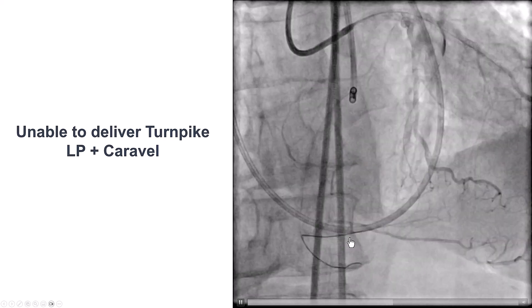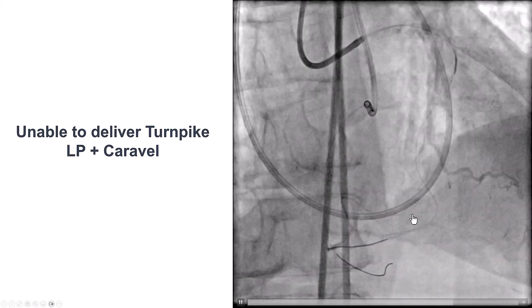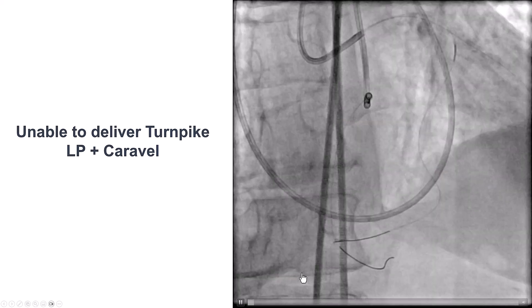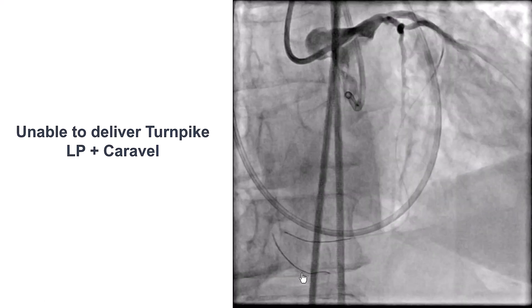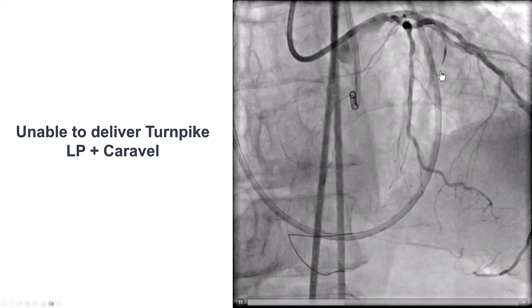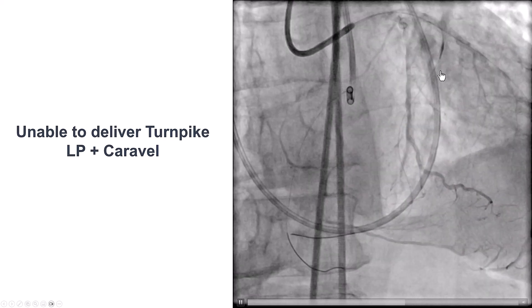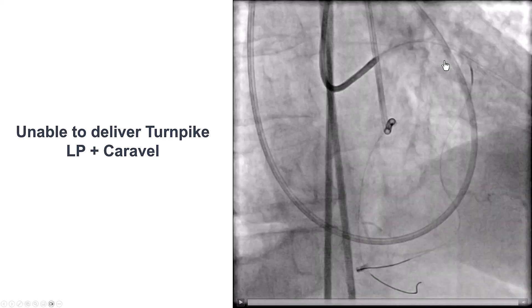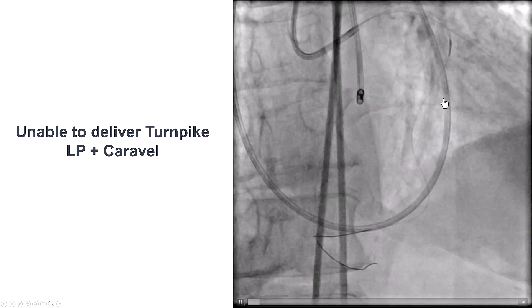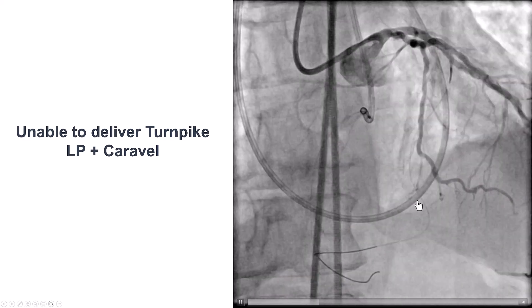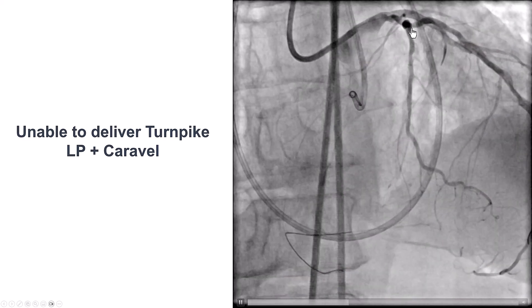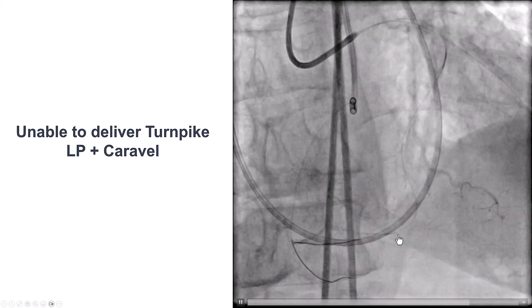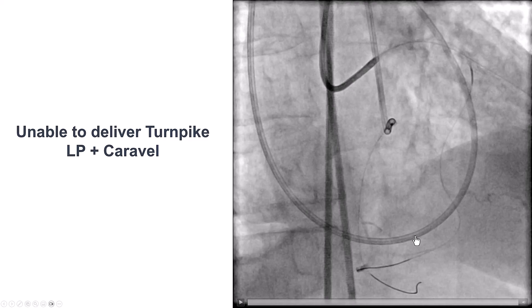Sure enough, our guide wire is through this collateral into the so-called second septal and close to the distal cap. The problem we had — not uncommon when going through small septal collaterals — was that we were unable to deliver the microcatheter. The Turnpike LP would not go. We switched to a Caravel and put in a 6 French guideliner, but still were unable to cross through this lesion.